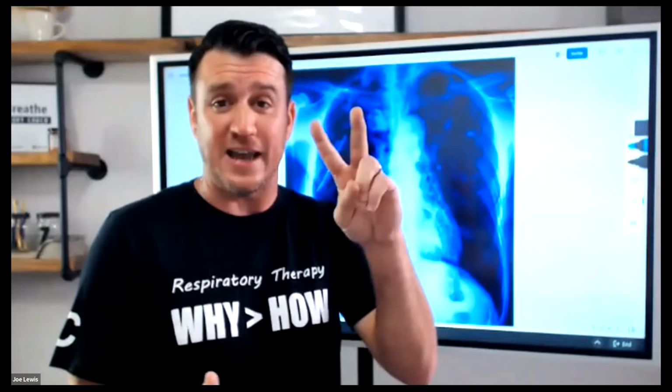We learned this back in school. What are the two biggest hazards of mechanical ventilation, right? Barotrauma and decreased venous return, which, interestingly enough, isn't even in this conversation today. But barotrauma is. So we want to make sure that we are monitoring our pressures. Now, how do we do this? Okay, so when I'm at the bedside, how am I thinking about how I can prevent barotrauma for my patient?